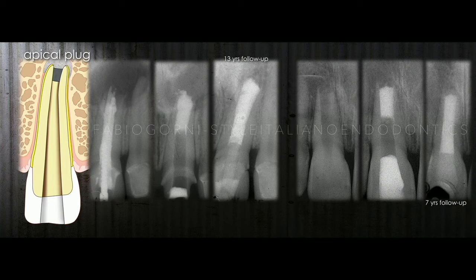The healing after 13 years is incredible. The same in the case of trauma in a young patient, in the case on your right, after 7 years.